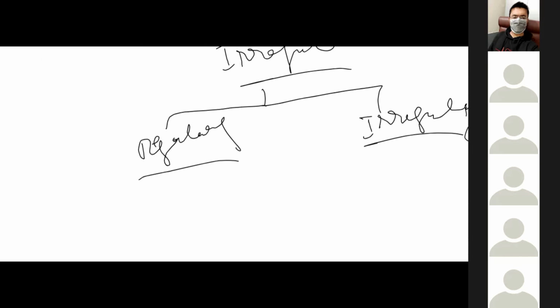Okay, so this is 0 degree, this is 90 degree, this is somewhat 60 degree, this is 120 degree, and this is minus 150 degree, and this is minus 30 degree. AVR and AVL. AVR is at minus 150 degree and AVL is at minus 30 degree.